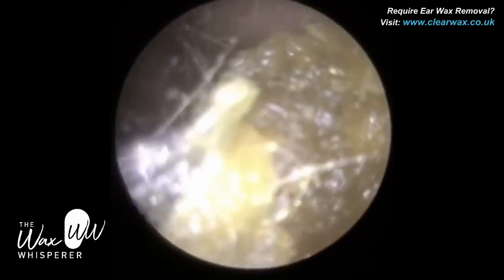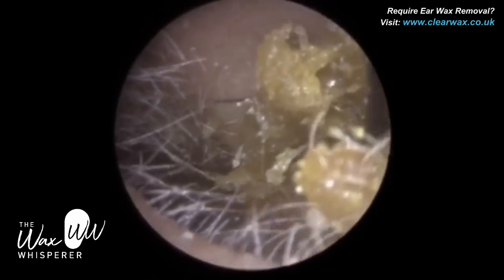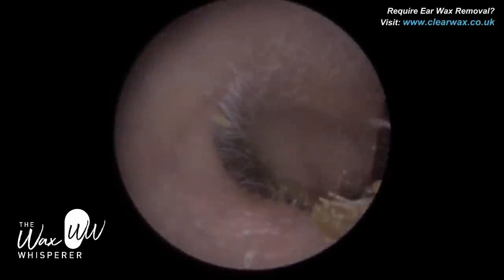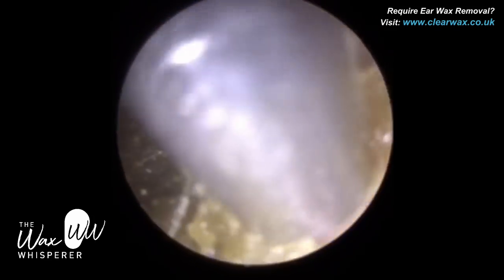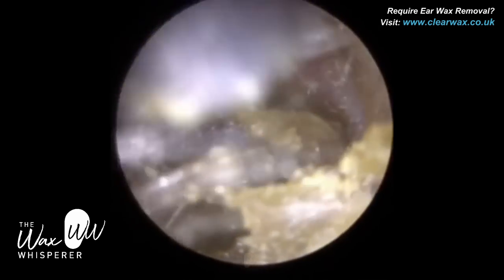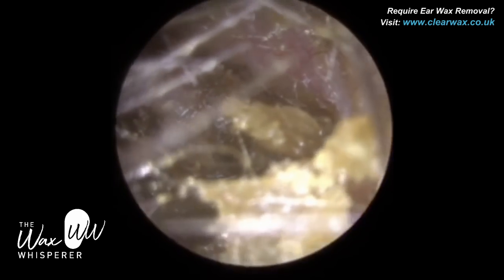Just near the entrance there. Now the rest of the plug of wax is a bit more medial, so I've reverted back to suction. When wax is more medial on the bony part, wherever possible try and avoid using ear hooks or Jobson horns, because if you come into contact with the bony part of the ear canal, it can be quite sensitive for the patient.